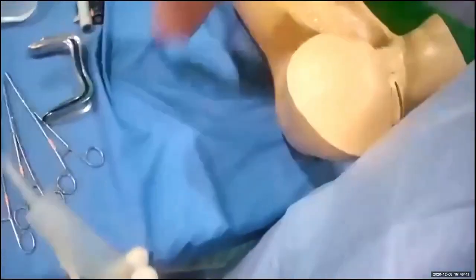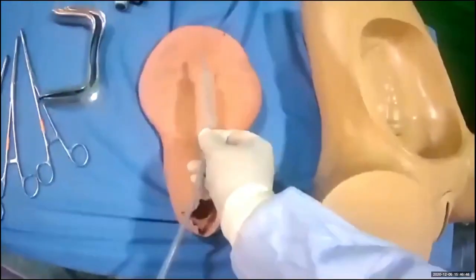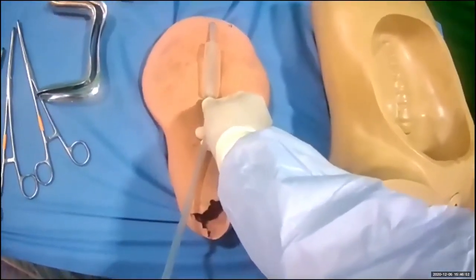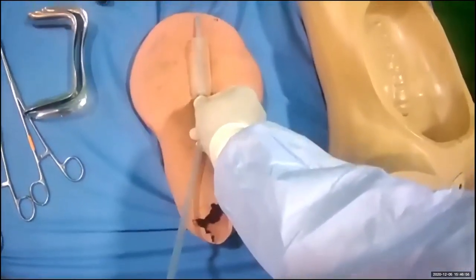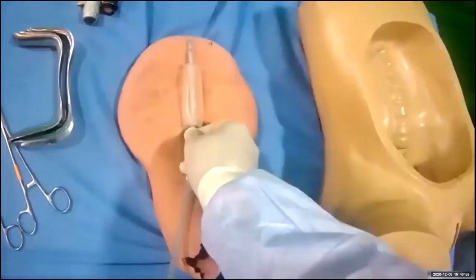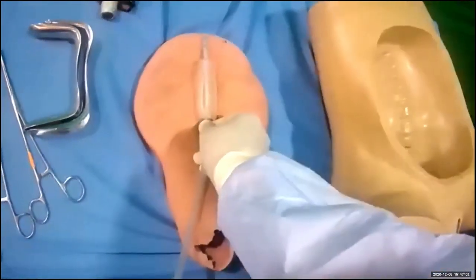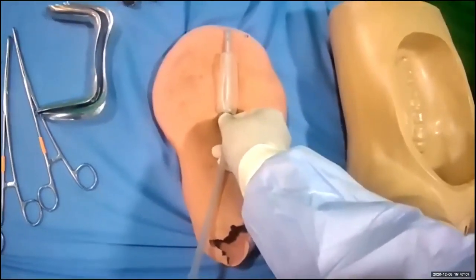The principle is to insert it under direct vision, right until you have reached the fundus of the uterus. How do you know you have reached the fundus? You will feel a resistance, and sometimes you can confirm this on an ultrasound scan. Once you are sure that you are in the uterine cavity, you can infuse fluids until the bleeding stops.